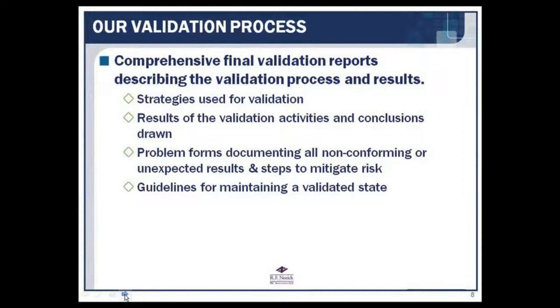We understand that when you use automation, that automation can reduce scripting errors because there's fewer keystrokes. But we also understand that we're not going to trust a piece of software. All of our validation managers go through and we review every single test result that comes out. Then we'll develop a comprehensive final report describing the validation process and results.